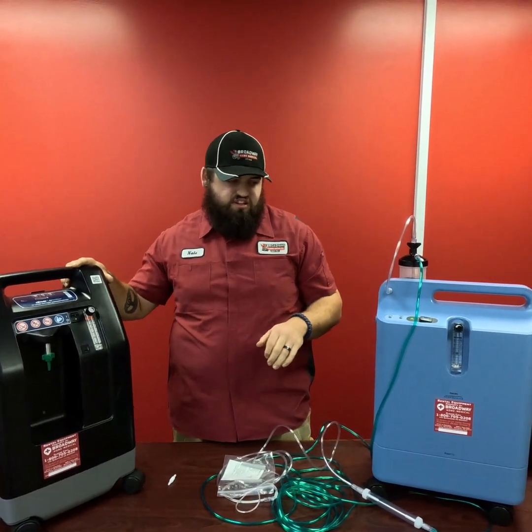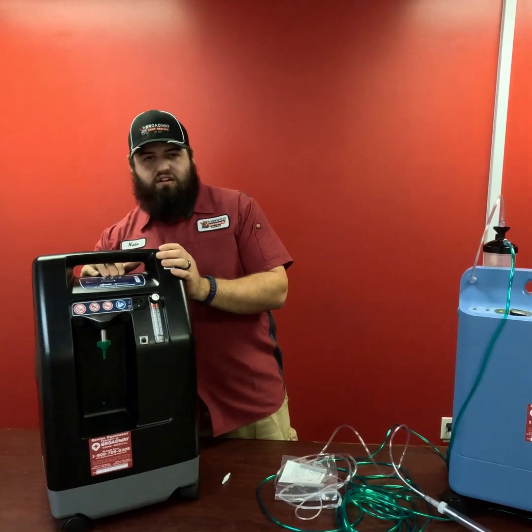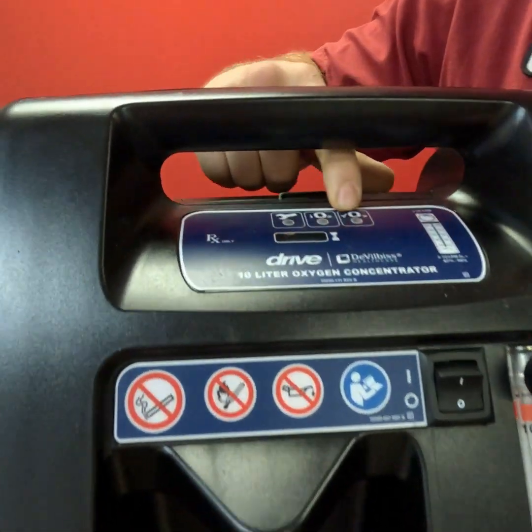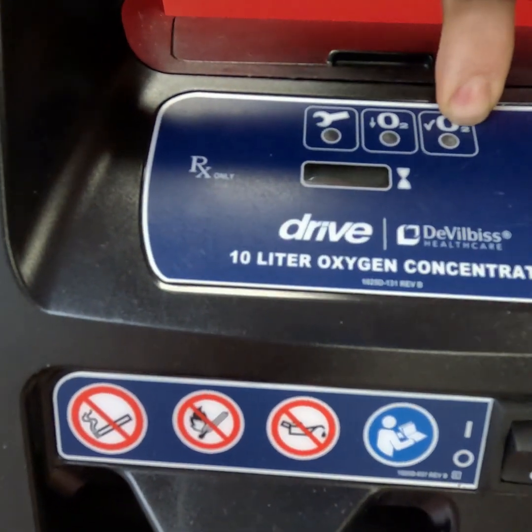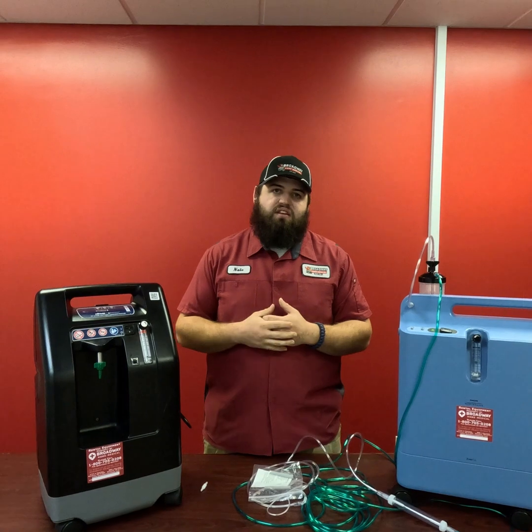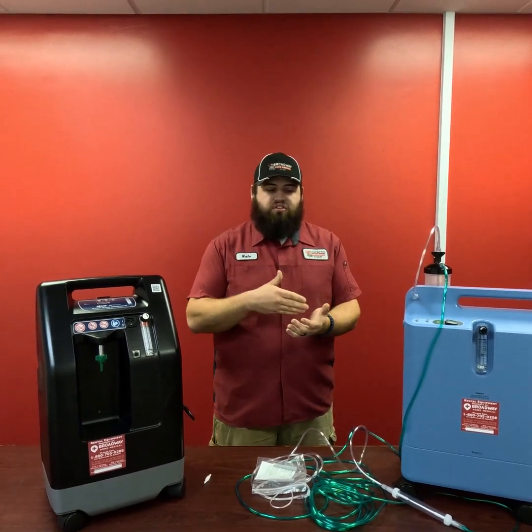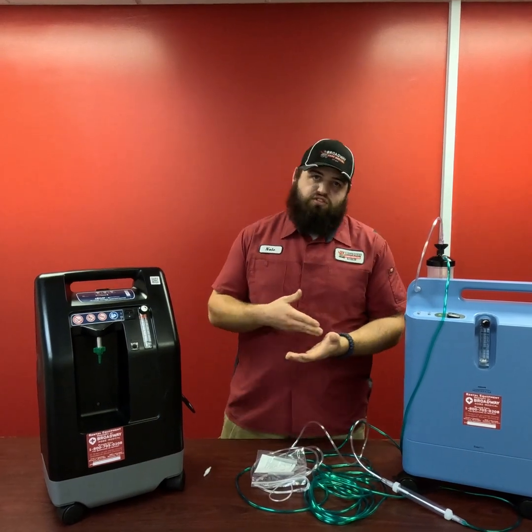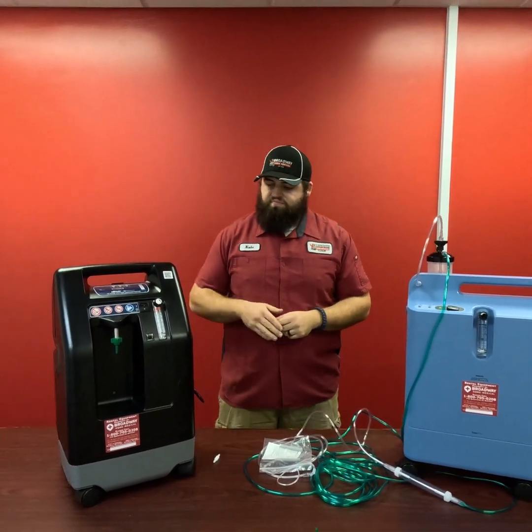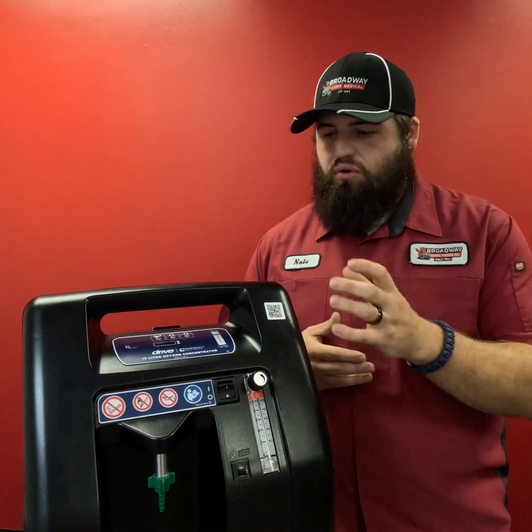Now, this machine here, I know we did go ahead and turn the EverFlo on, and you saw all the lights. This machine does have all the same kind of light setup. We have a red light, orange light, and a green light. Now sometimes with these machines, when you first turn them on, you do have to allow a few minutes to let them run and build purity to allow the machine to actually switch over to a green light. Now this machine here switched straight over to a green light. It had purity just like that. But normally with these 10-liter machines, they do take a little bit longer. And I always like to tell folks, allow at least up to 5 to 10 minutes for that amber light or that orange light to switch over to a green light.